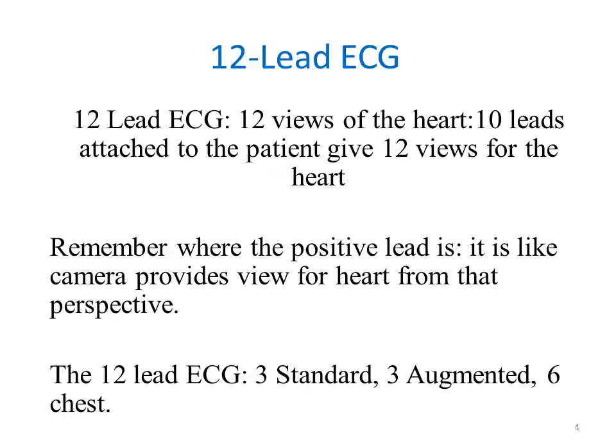We have to remember that where the positive lead is, it's like a camera and provides a view of the heart from that perspective. The 12 lead ECG: 3 standard leads, 3 augmented leads, and 6 chest leads.